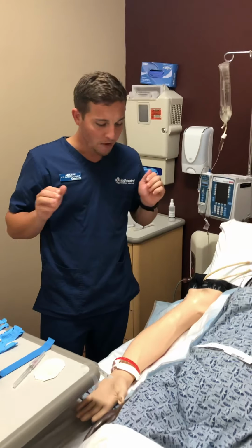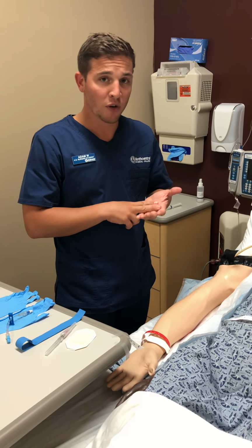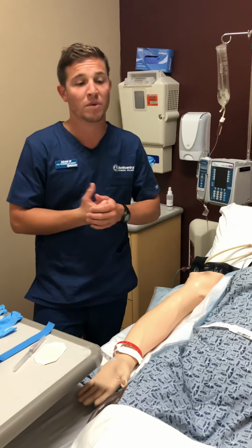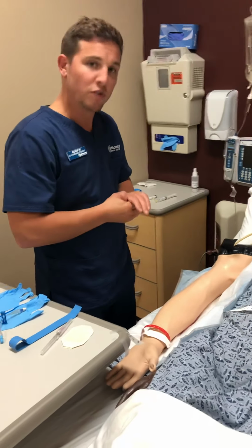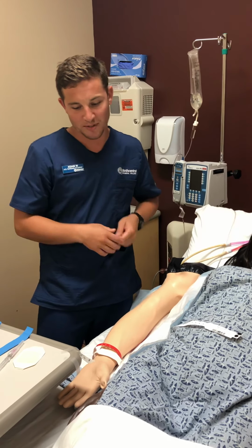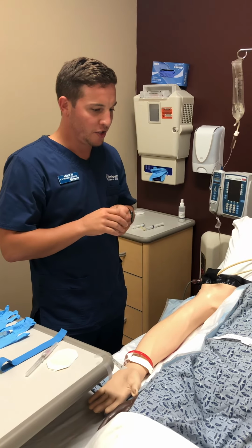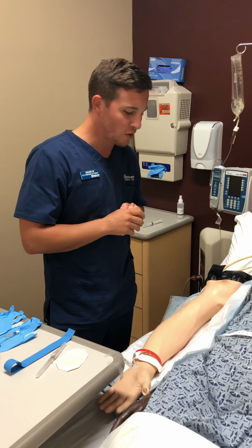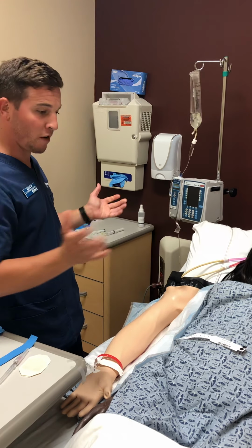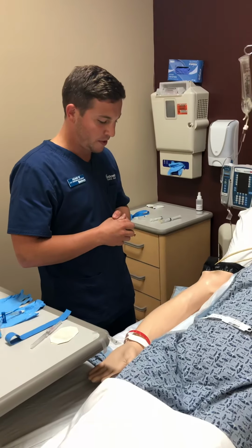All right, so first things first, I asked her if she has any fistulas. Any lymph nodes removed, and we ask this because these are contraindicated to have an IV inserted. We have to use a different extremity if so. She does not have any of these, and usually we use the non-dominant arm. So in this case, it's her right side, but it's her left arm here. So I also assessed that she is able to follow commands, which is also important. So she's able to do so. So I also have her in a supine position, high fowlers, and she's comfortable, she says. Her arm is in a dependent position. This is the position that we like for this type of procedure.